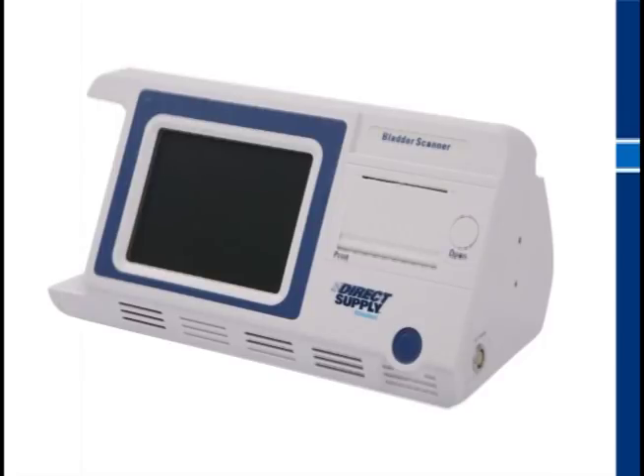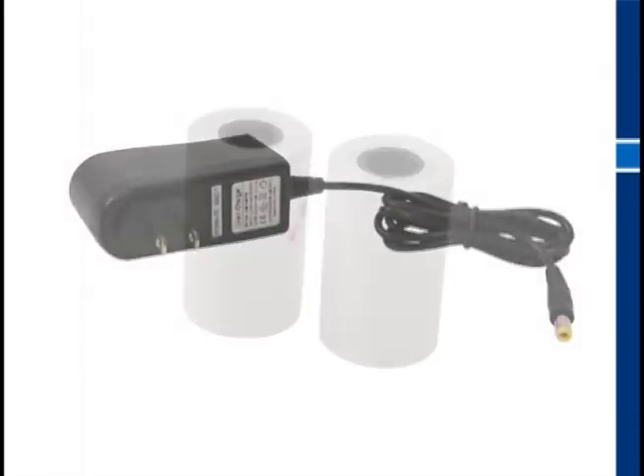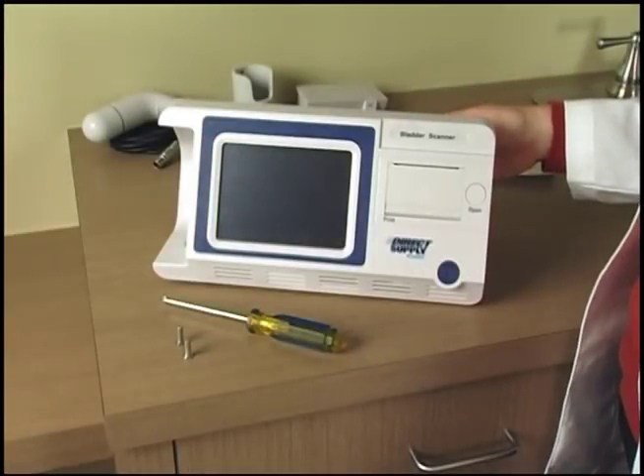When you open the box, your attendant bladder scanner should include the scanner itself, a probe, a probe holster, two batteries, a battery charger, a roll of thermal paper, an owner's manual, and a quick start guide. If you are missing any of these items, call your account manager. You'll need a Phillips head screwdriver for some basic assembly.